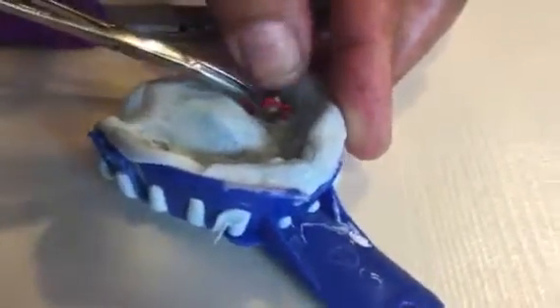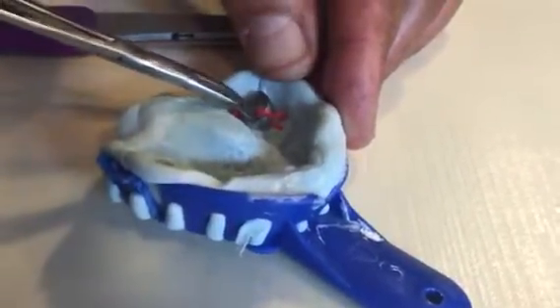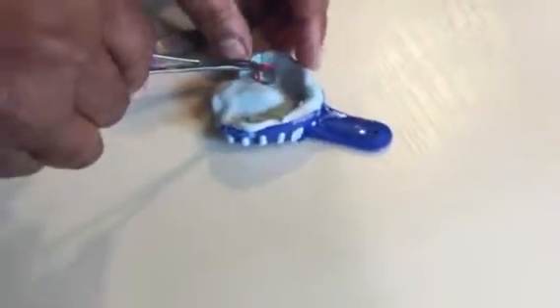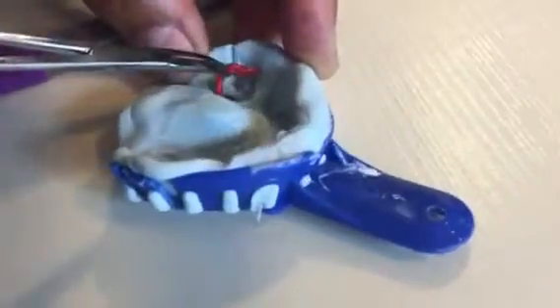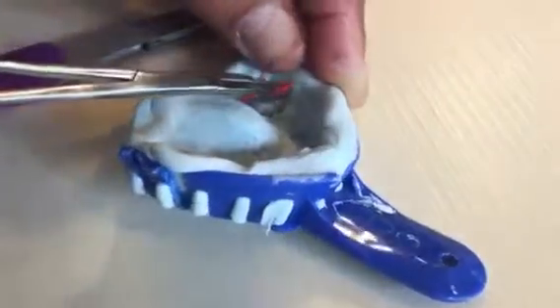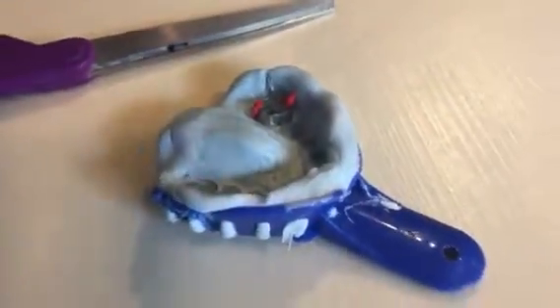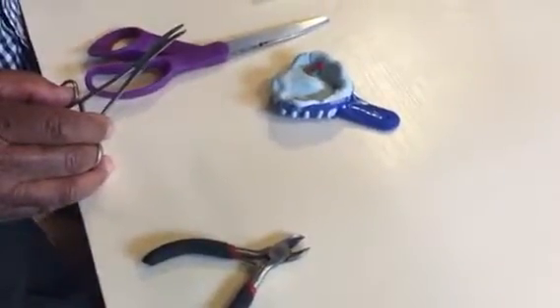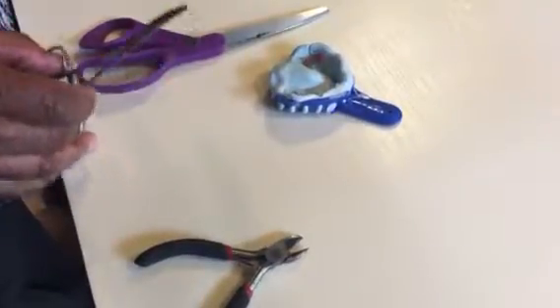We are not using live alginate material here just for demonstration purposes. We're using a polyvinyl, and so therefore that's why this is difficult to demonstrate. But basically that's the results that you're looking for as soon as I can manipulate this into place. Anyway, continue to seat the Dballock over the gingival edge of the band with the straight leg positioned on the inside diameter of the band and the curly leg positioned on the outside.